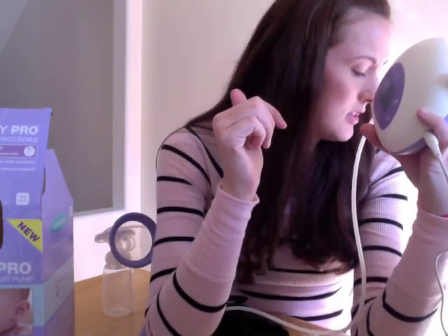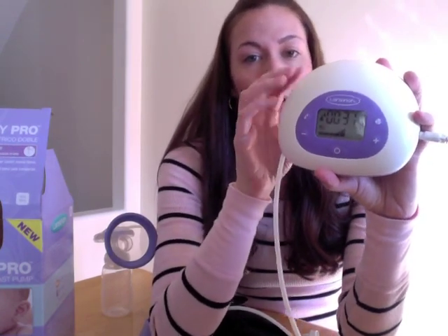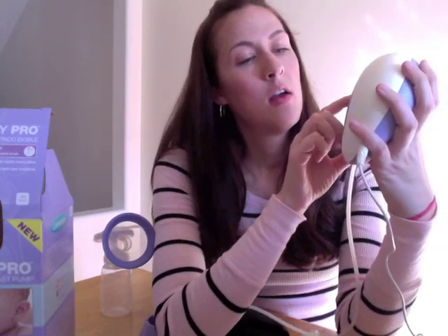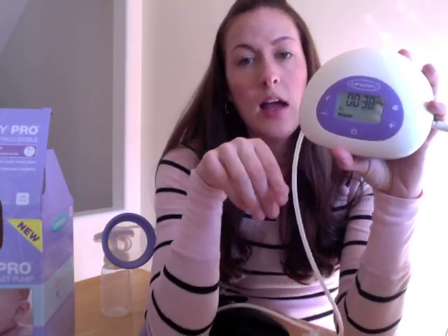It actually has two different phases — the stimulation phase and the expression phase. When your baby starts sucking during breastfeeding, there's a stimulation phase where the baby sucks a little faster and harder to encourage the letdown of milk. That goes on for two minutes and it's a little bit faster — you can hear the pulsing. After two minutes it automatically goes to the expression stage, which is slower. You can change it anytime you want.